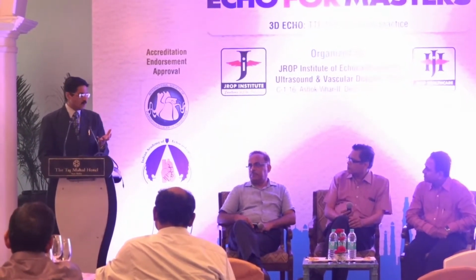See, very good question, sir. Actually, it is not that every operation theater has 3D. Still, many centers are working with 2D only, with an assumption of what the pathology could be. But if we have 3D as part of our routine practice, then definitely before getting into the surgery, they have an exact idea of what they are supposed to do. Like in one of the cases, when they thought it could be SAM or something else, but when we showed that it is in fact a vegetation of the anterior leaflet which is just going into the LVOT.